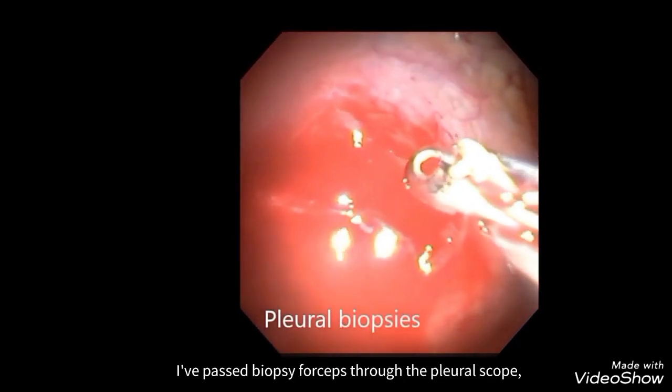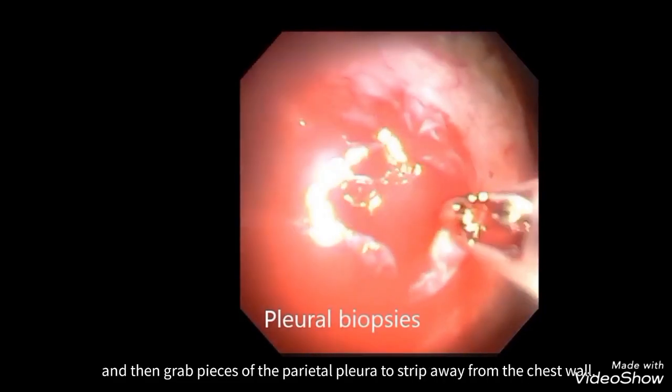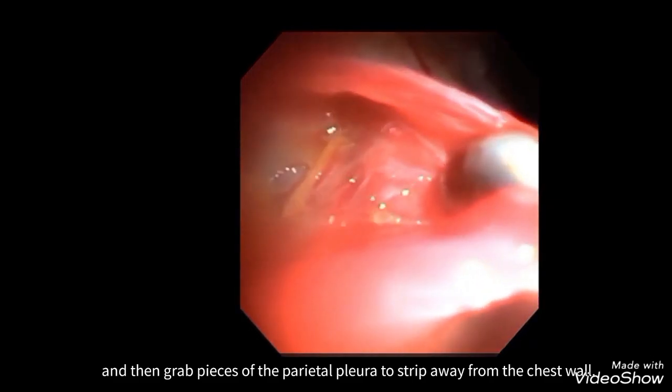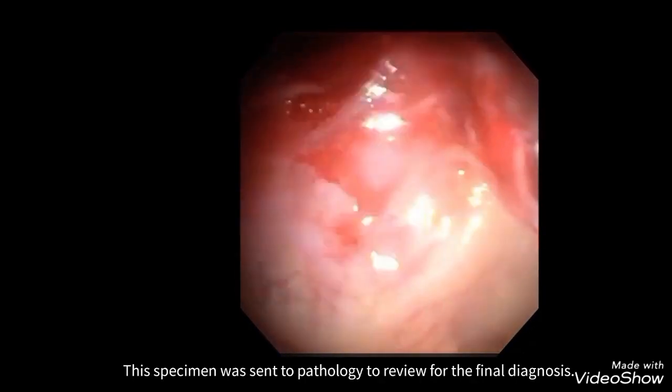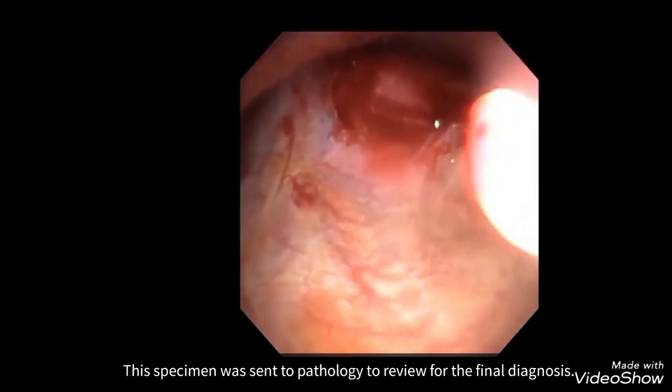I've passed biopsy forceps through the pleuroscope, and I grab pieces of the parietal pleura to strip away from the chest wall. This specimen is sent to pathology to review for the final diagnosis.